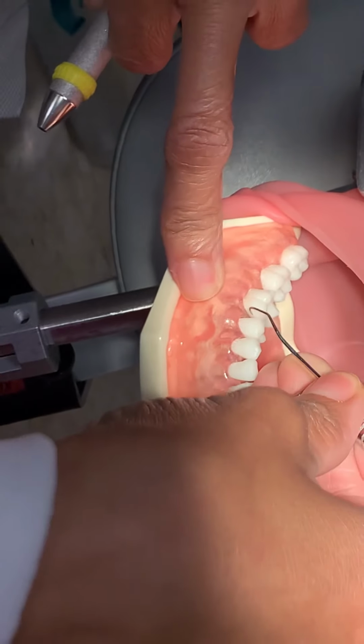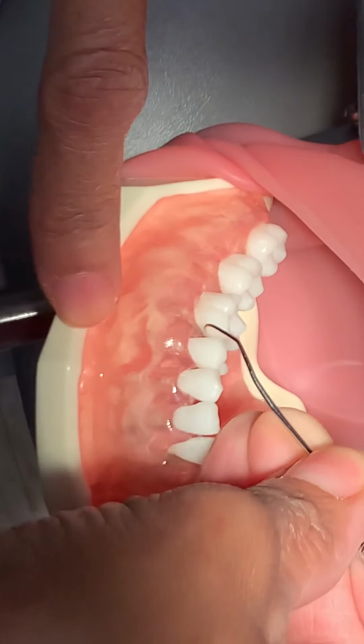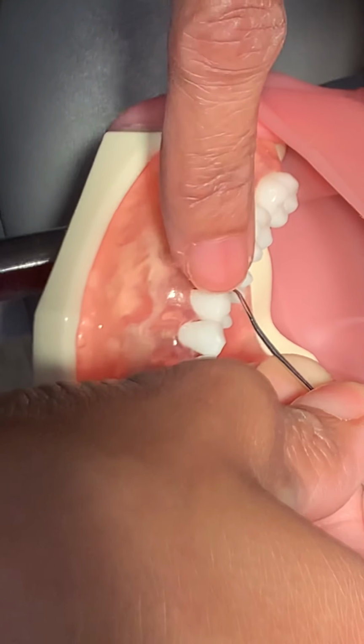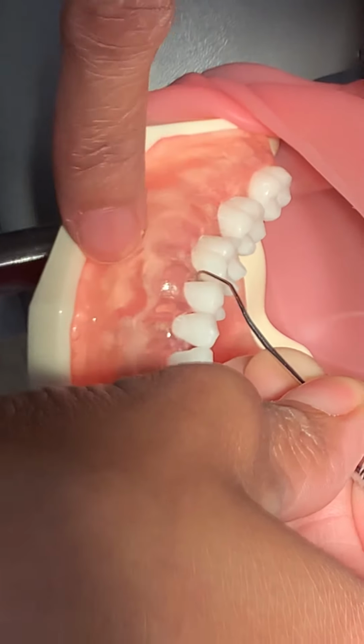If your terminal shank is parallel to the posterior tooth, normally we choose the premolar. So if your terminal shank is parallel to the proximal surface of the premolar, your functional shank will be up and over. So this will be your correct working end, and you can flip it, and you will see. Excuse me, let me go back to the correct working end.